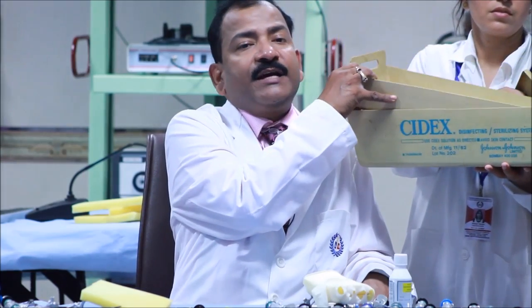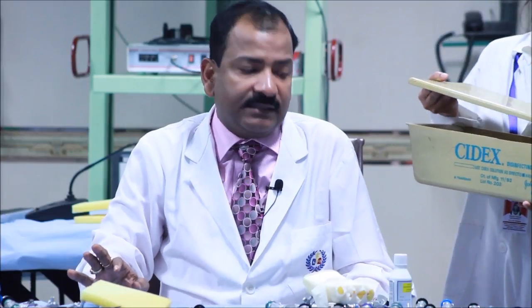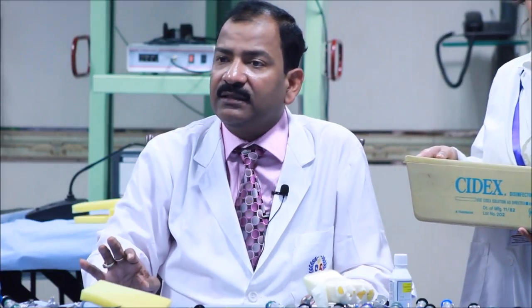Contact time is 6 to 8 hours if you want 100% sterilized. 6 to 8 hours. But if you want only bactericidal, then half an hour. Glutaraldehyde is a very good virucidal. Virus, it kills within 30 seconds. It is a very good bactericidal also. Within 15 to 20 minutes, maximum half an hour, it will kill the bacteria also.